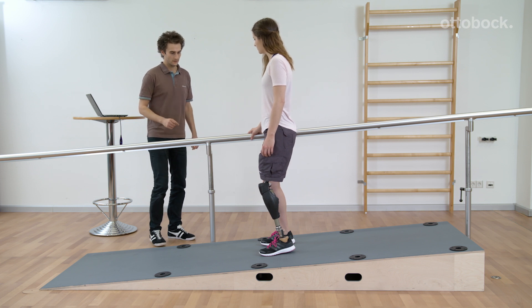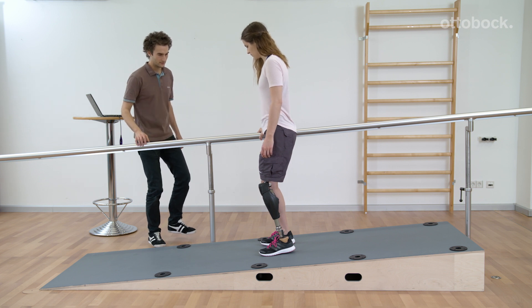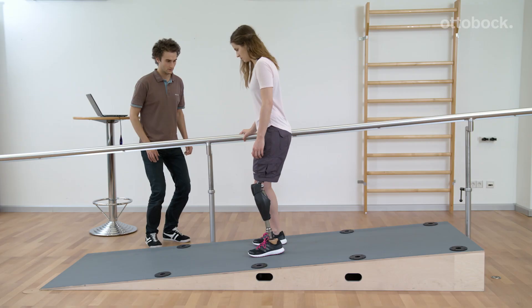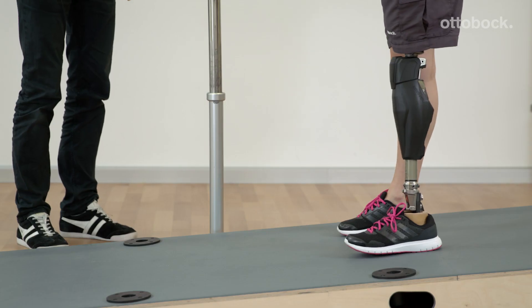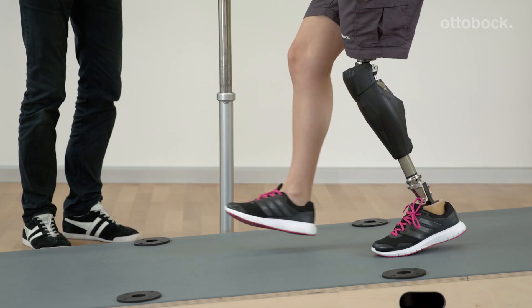To exit the intuitive stance function, at least one of these three criteria has to be met: 1. Unweighting of the prosthesis, 2. Extension of the knee joint, or 3. Tilting the lower leg forwards or backwards.